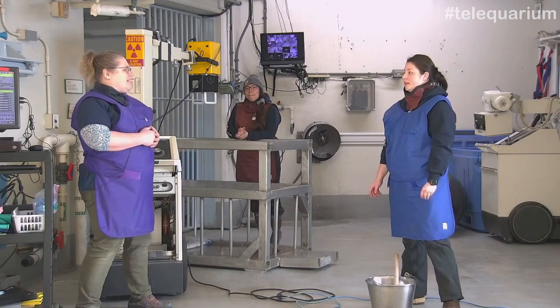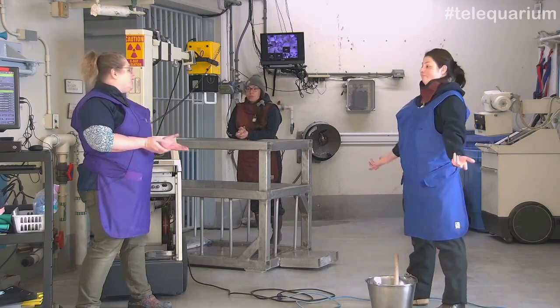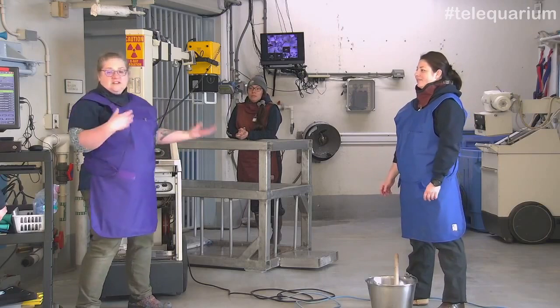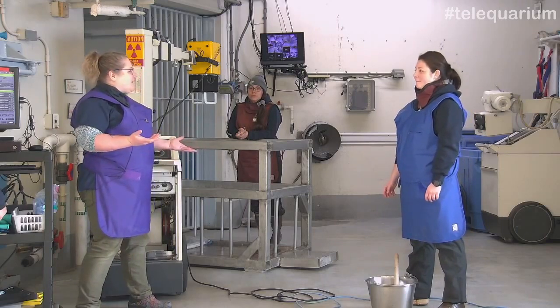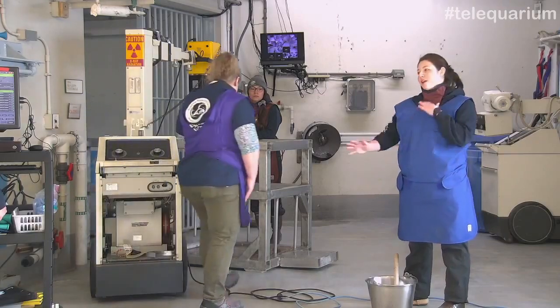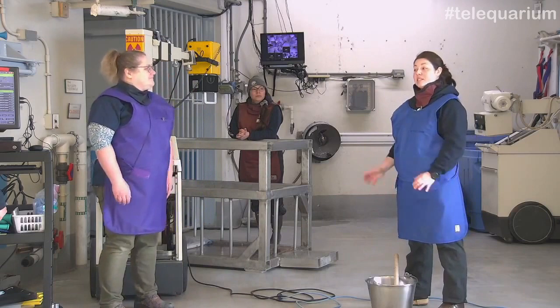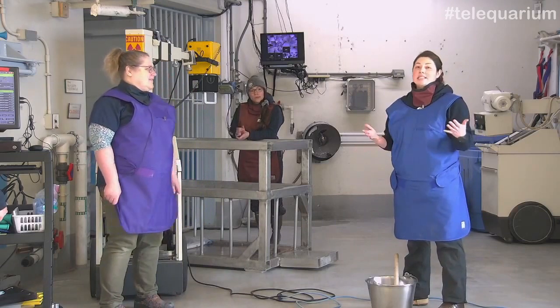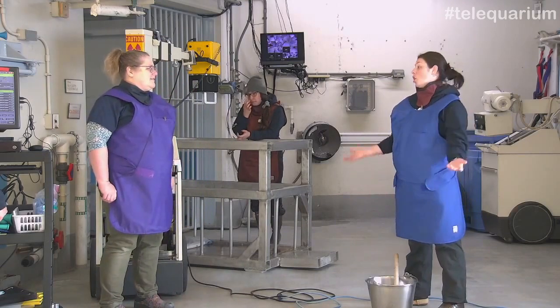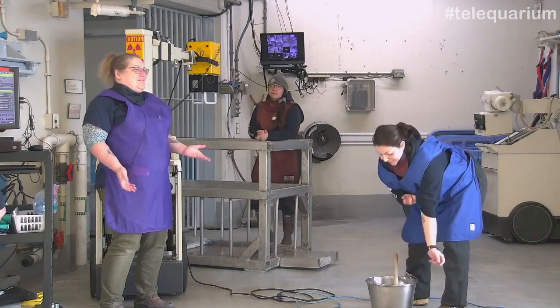Yeah. So definitely, even if it doesn't work out, this has still been positive because she's gone into the shoot. She's recognized all the extra things happening. And so it's still a training session. Mara is still learning by everything that we're doing right now. Every fish I give her, she's learning through. So this is still actually just a really great desensitization training session for her, regardless of successful X-ray. And again, she's pregnant, so maybe she just doesn't feel good.